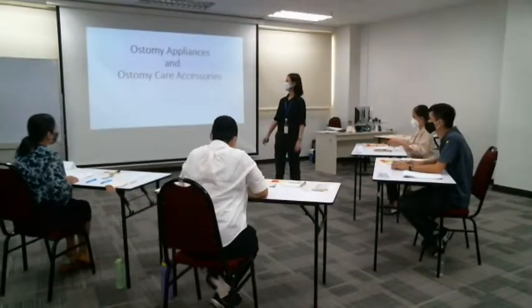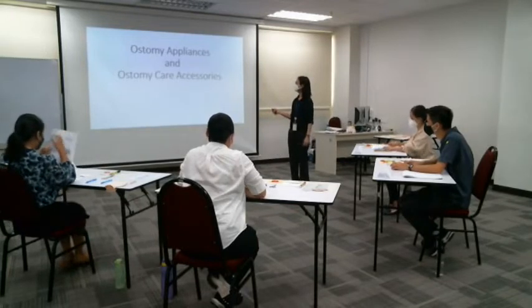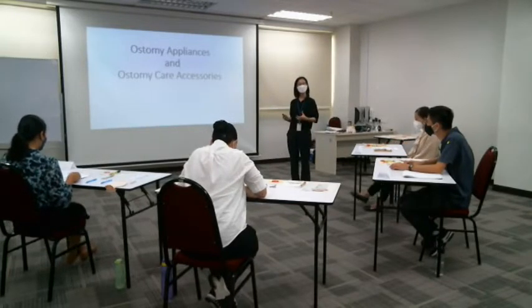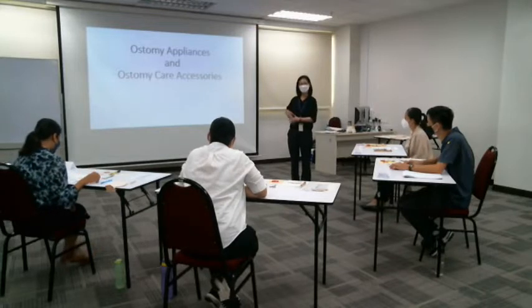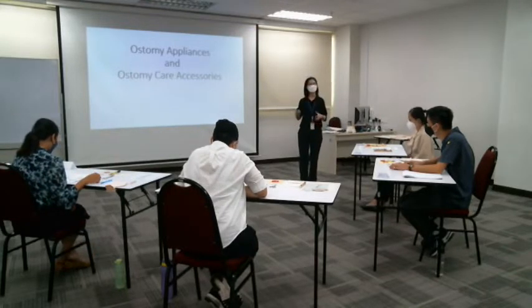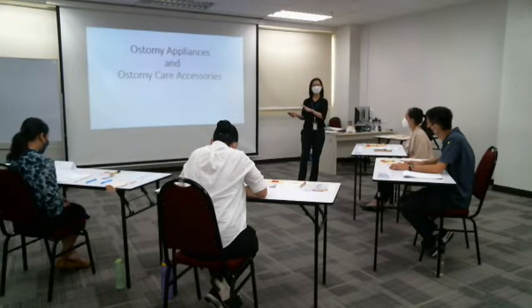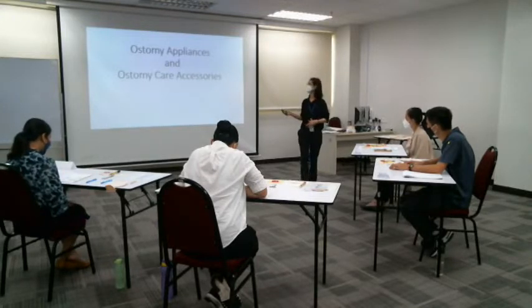Everyone, so we continue with the next topic. This is about ostomy appliances. That means the equipment that we need to put on the stoma, right? And ostomy care accessories. So besides the main equipment, what are the other care accessories? It's more for skincare on that area.